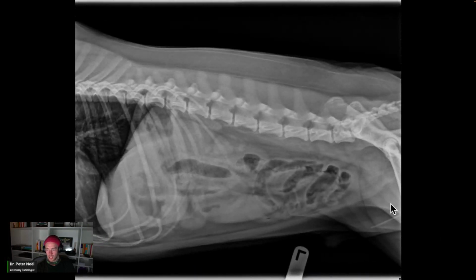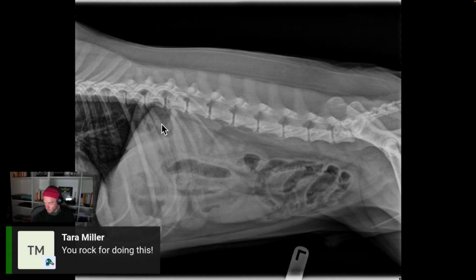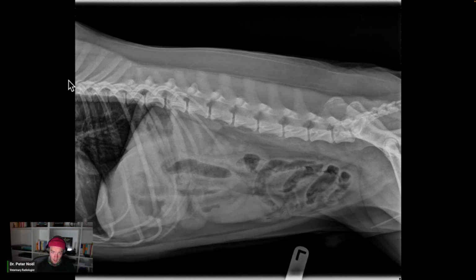Three views. Acute vomiting. This is a dog. It's a male dog. He's probably 3. He's acutely vomiting. Same thing. The goal for you is to decide if he's obstructed or not. But the next layer, if you are uncertain, is to practice that clinical sort of, what would I do? And would I do what Peter would recommend in terms of any follow-up diagnostics? Okay. Yeah, you guys are all welcome.